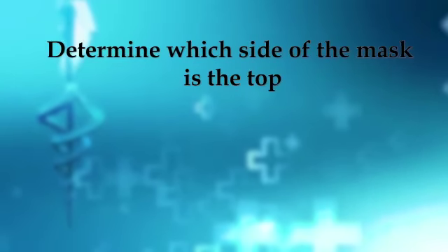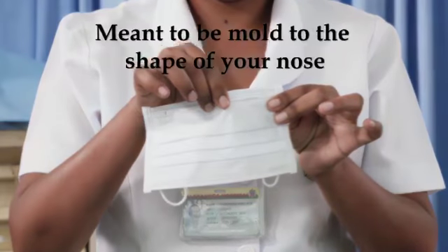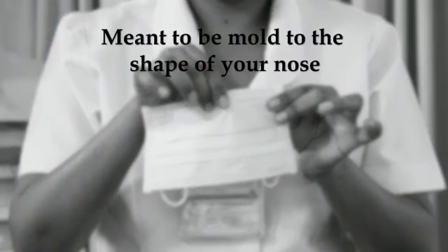Determine which side of the mask is the top. The side of the mask that has a stiff bendable edge is the top and is meant to be molded to the shape of your nose.